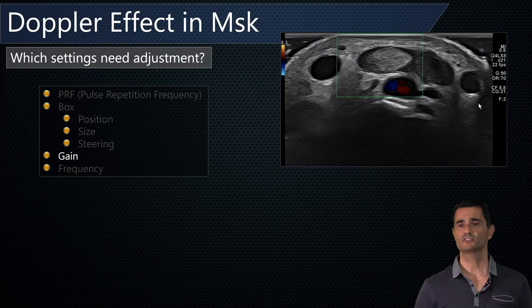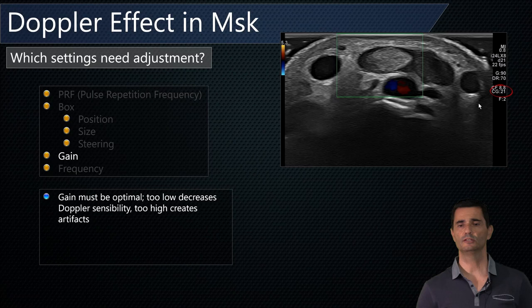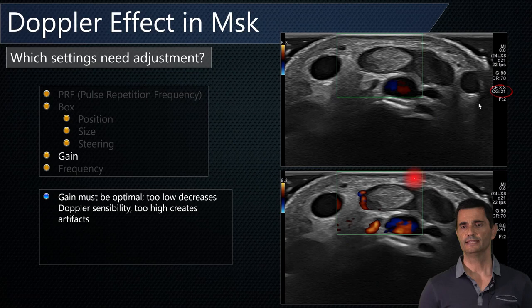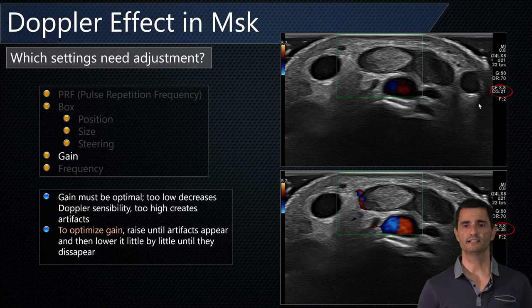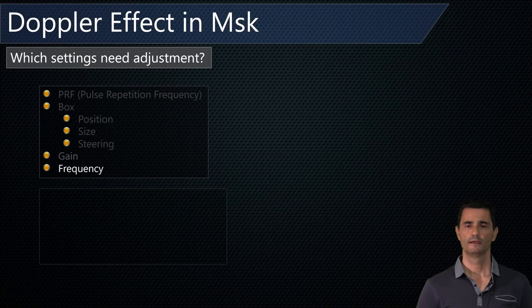Gain is the brightness of the Doppler. With low gain, the Doppler will be less sensitive. With higher gain, artifacts will appear. The best approach is to slowly increase the gain until the first artifacts appear, then decrease it slightly until the artifacts disappear — this gives you the optimal gain setting.